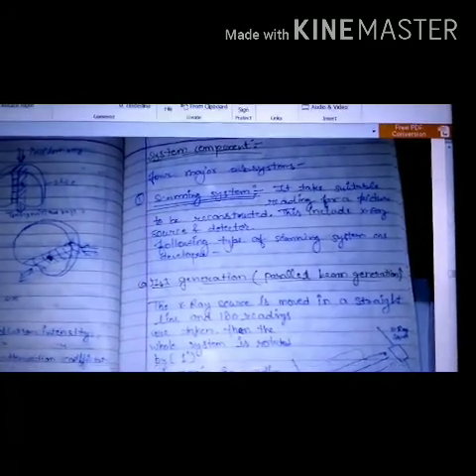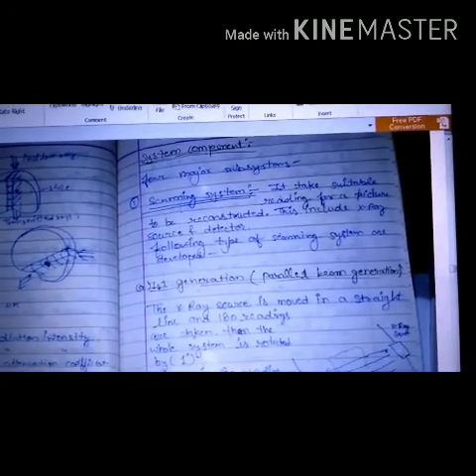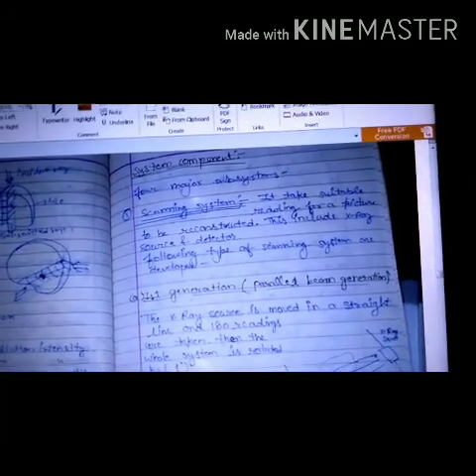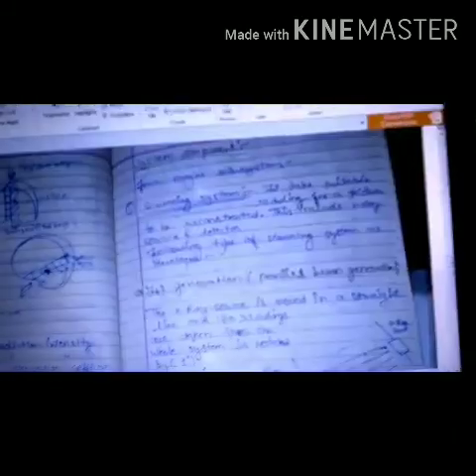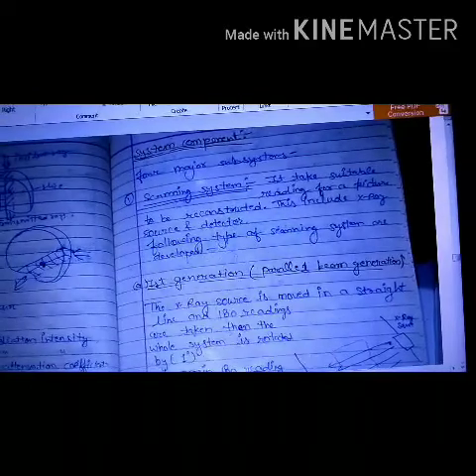Suppose we are focusing on the human lungs, which is in a particular plane in our body, and we are taking images from all around our body: front, back, left, right, and all the 4 positions between them.